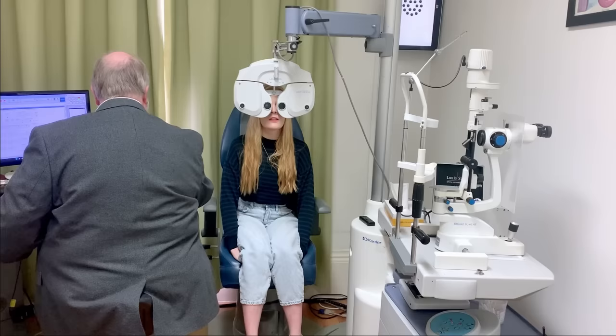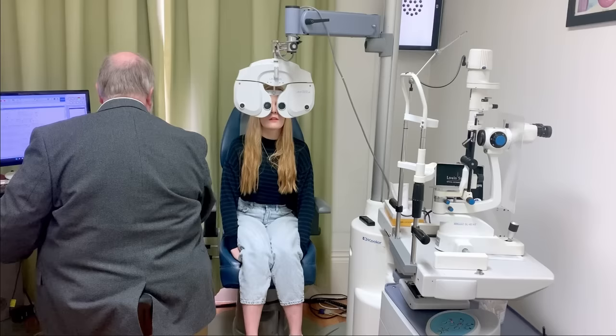Okay, let me just pop it there. And again, any better with one or with two? One, yeah. One's a bit better, yeah? Yeah, one's much better now. Okay.